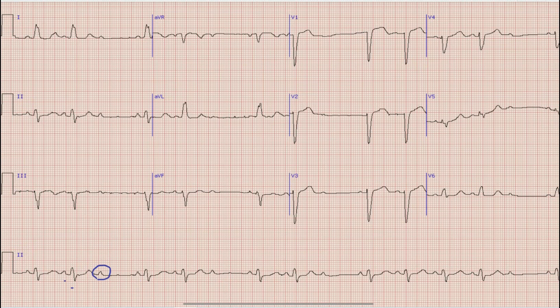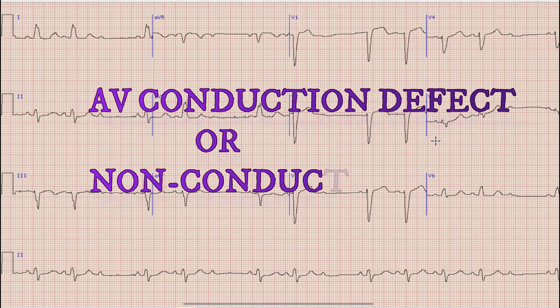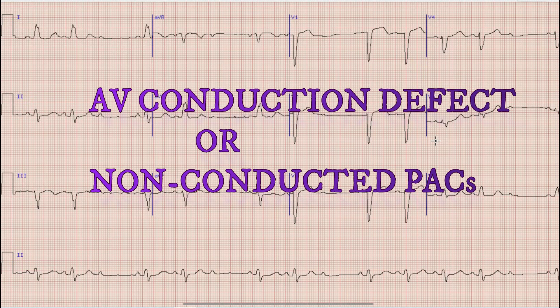Whenever you find this type of pattern where a P wave is not being conducted, there could be two possibilities: either there is an atrioventricular conduction defect, or there may be premature atrial contractions which are not conducted to the ventricles — which are called non-conducted PACs.